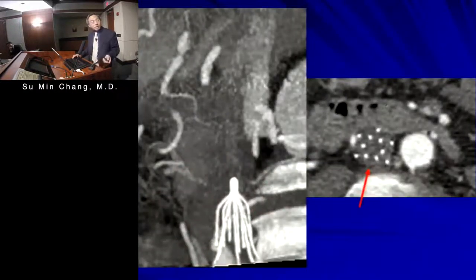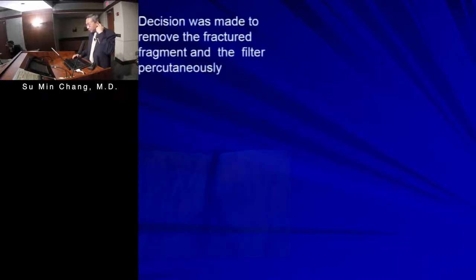As you can see, the patient had a history of an IVC filter put in, and it was supposed to have 12 struts, and only one of the posterior ones is missing. So basically a rupture and embolization of the strut, causing a myocardial pericarditis. It's amazing it went to the left side.